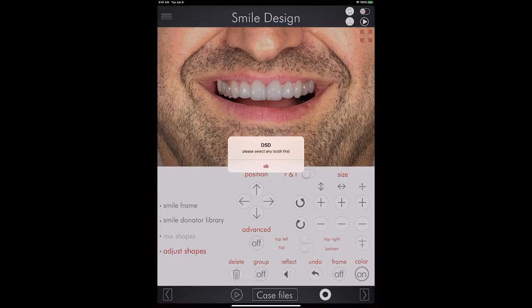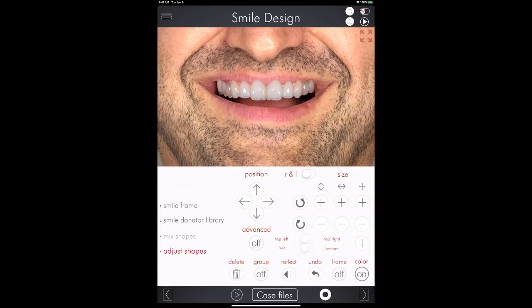We see that the distal line of the premolars needs to be parallel, right? So the rotation of the tooth needs to be exactly the same like the premolar, and then molar, or just slightly different, but that makes the beauty of the inclination of the smile.